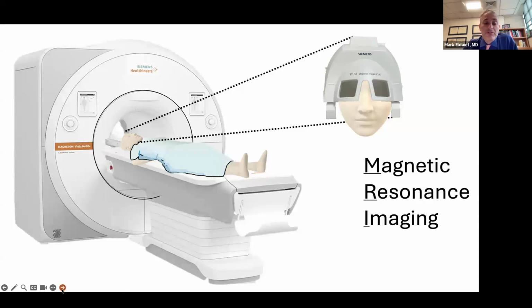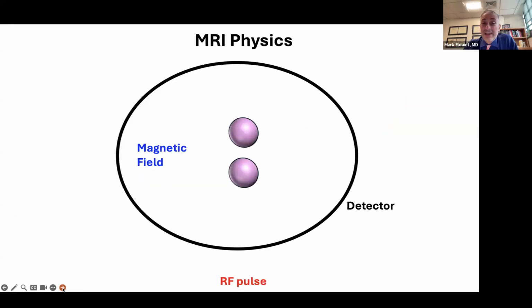So some of you might be interested to really talk about quickly how MRIs work. So I'm just going to really quickly go into that. What happens in an MRI is that you are trying to excite these protons that are throughout your body. You have trillions and trillions of protons in your body.